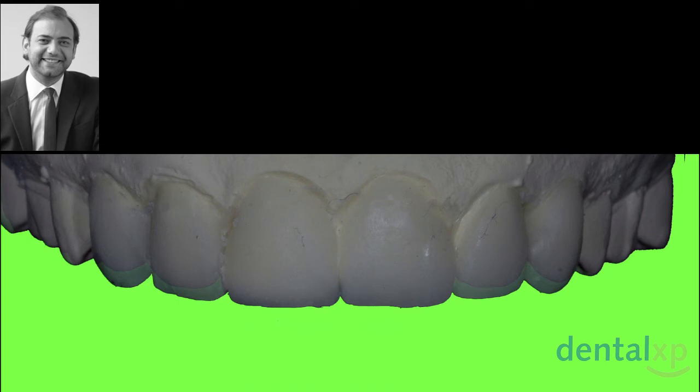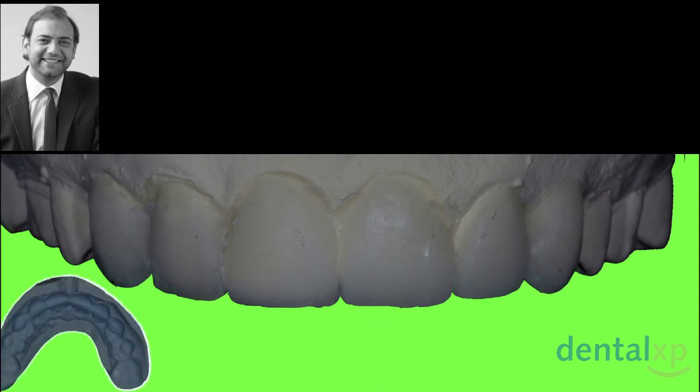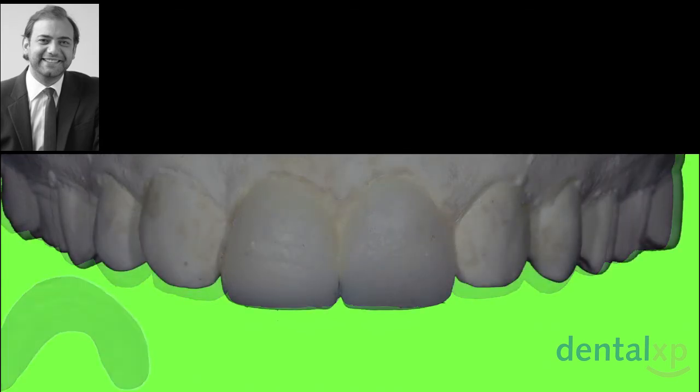We do the mock-up, described by another great friend, Galip Gurel, and we let the patient choose. Now, I know that we are going to do surgery, but this is how we gain trust from our patient, and it's easier for them to understand that surgery is not the whole thing, and prosthetics are as equally, if not more, important.